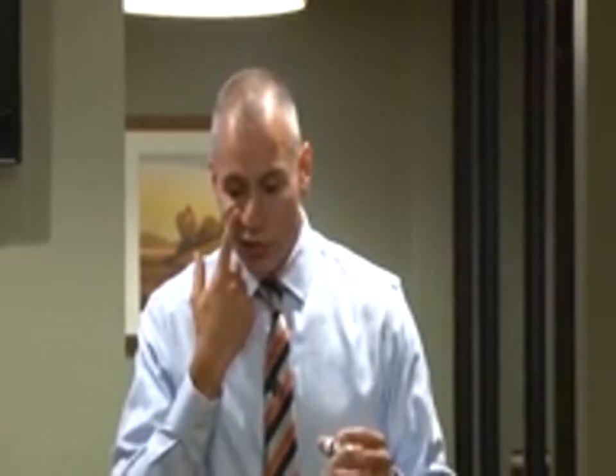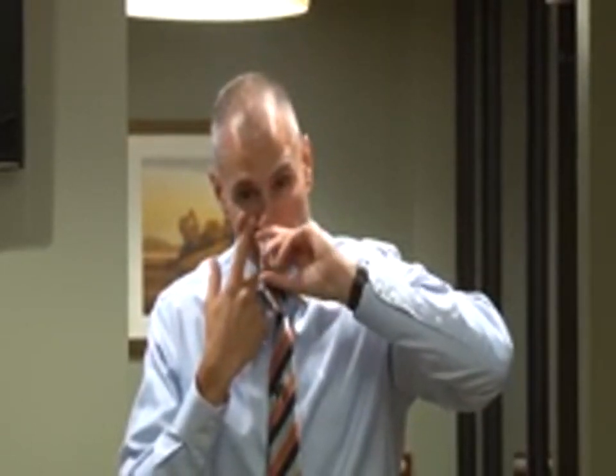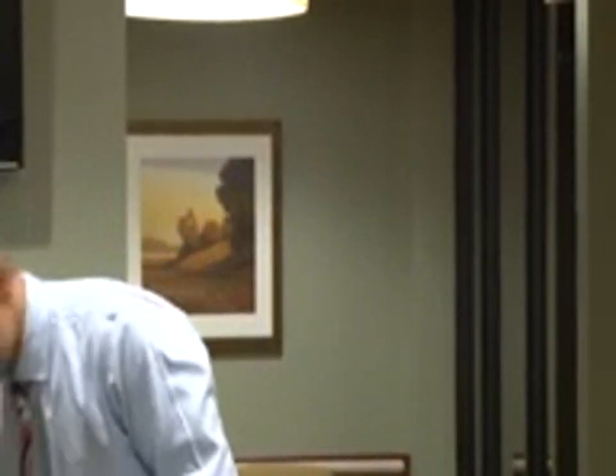The proper technique for spraying the right side is head down. You pull your right nostril out with your right finger, and you spray just the opposite with your left hand. And you might need to sniff again after you put the spray in. Sniff slightly to keep the medication in the nose. Okay? So that's the proper way of using a nasal spray.